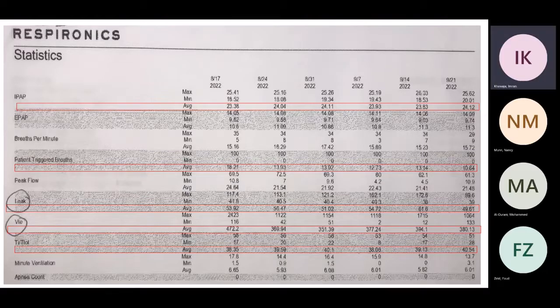Next. Down. Okay, so this is the one that I told you earlier. I told you to hold on this Ti/Ttot. So this is the I to E ratio, right? If you're dealing with someone with COPD, what is the percentage that I told you? 25%, which is almost an I to E of 1 to 3.